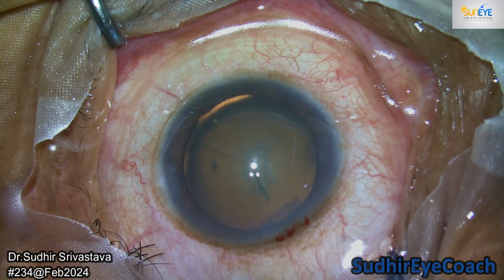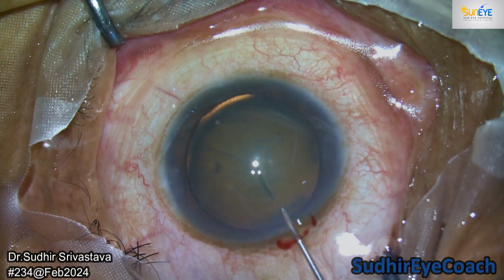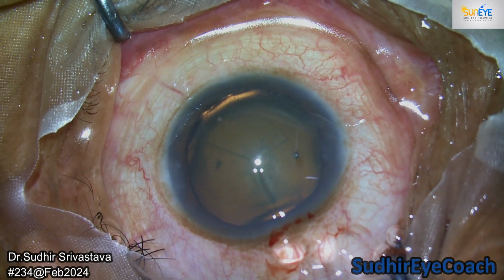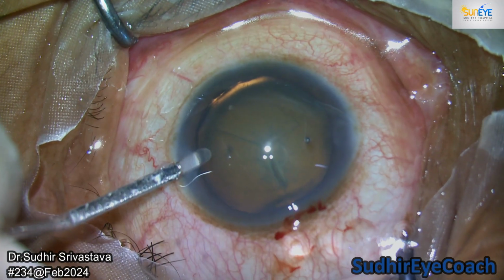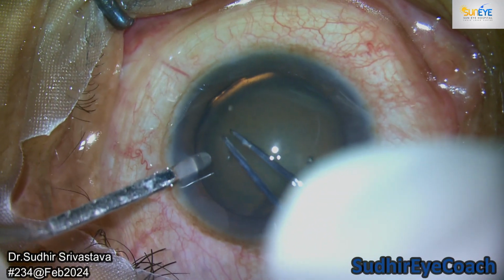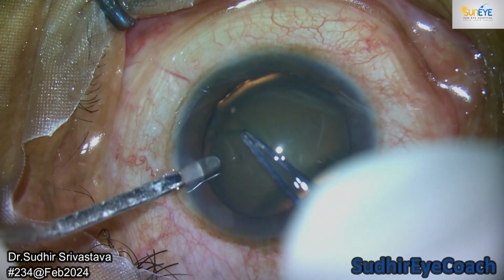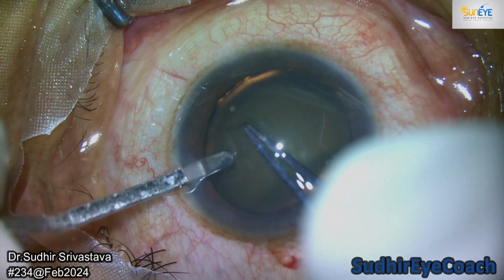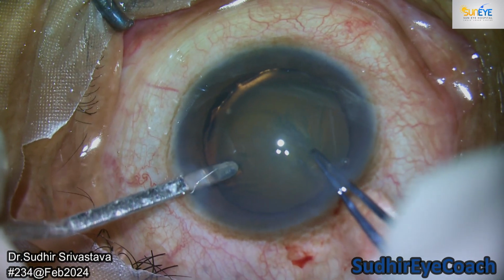Propagation of capsulorhexis will be difficult in the area of subluxation because the zonular traction is not there. So I found it better to continue the rhexis with the cystitome, so I filled the chamber once again and used Utrata forceps, because with the Utrata forceps you can give more traction to the capsule.